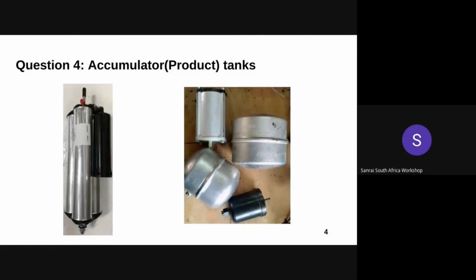Lastly, and a very important reason to take note of, is that the product tank of an SF Elite contains zeolite, which helps in further purification of the oxygen coming from the sieve beds. And it also helps in stabilizing the oxygen in the product tank. So it is always best to replace the tank with one from the same concentrator model.